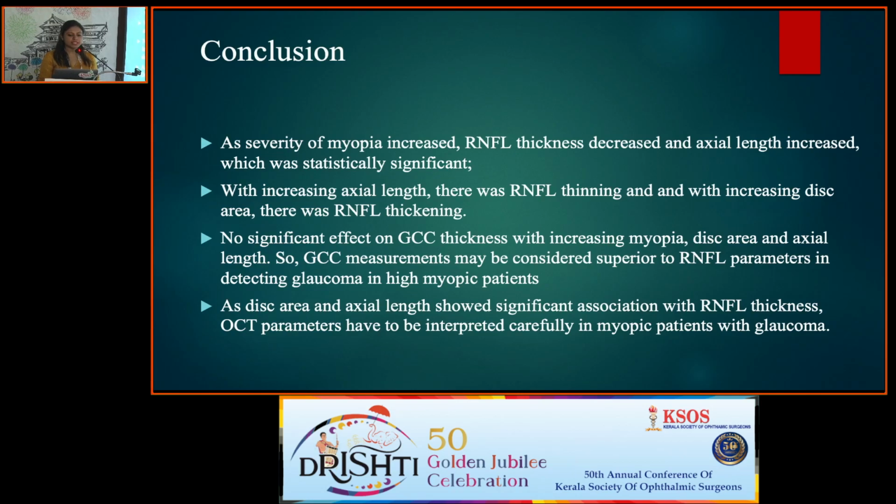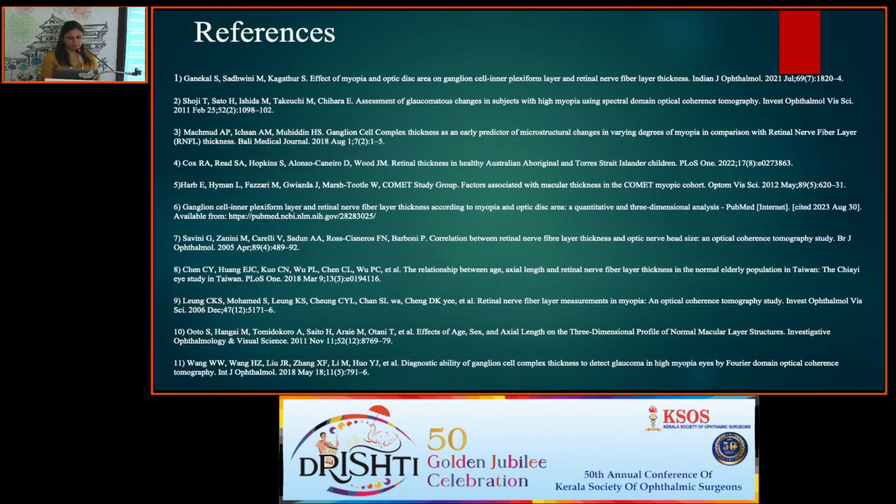So GCC measurements can be considered superior to RNFL parameters in detecting glaucoma in high myopic patients. As disc area and axial length showed significant association with RNFL thickness, OCT parameters have to be interpreted carefully in myopic patients with glaucoma. These are my references.